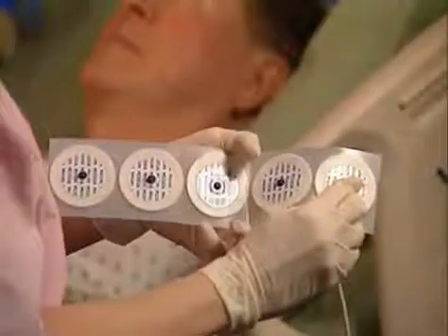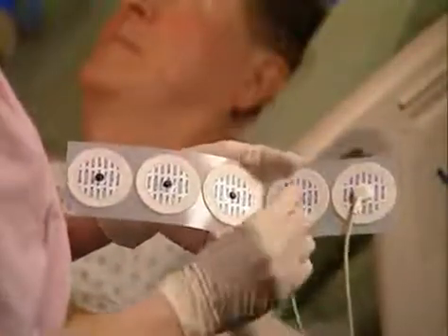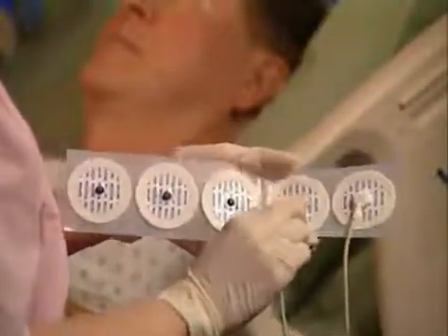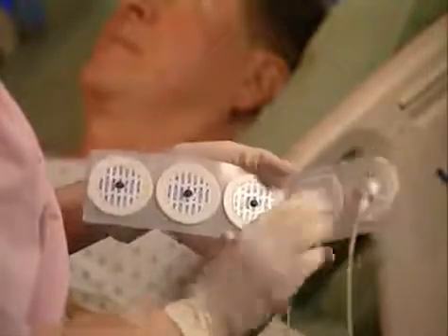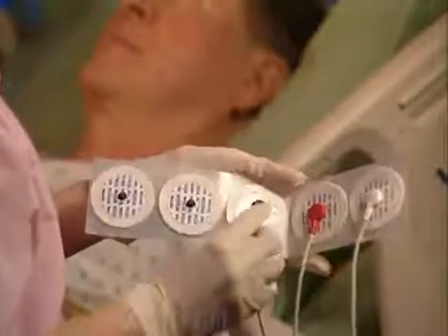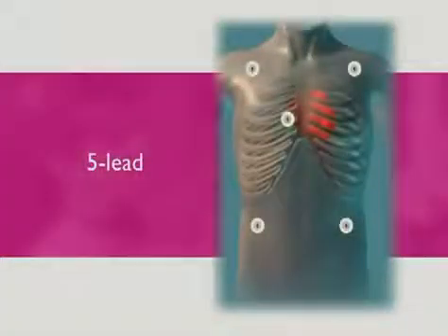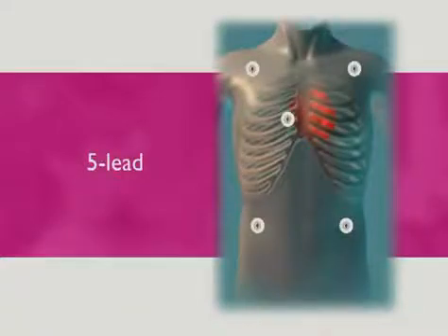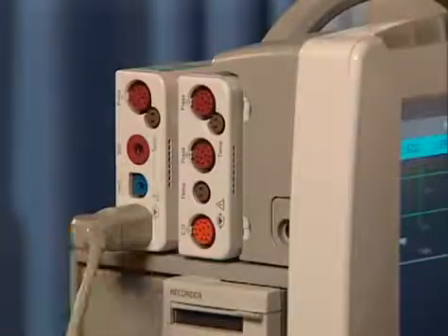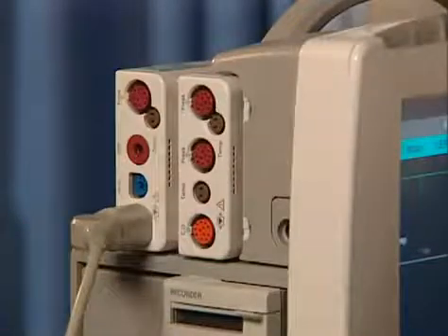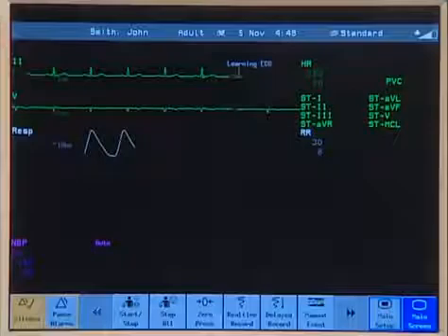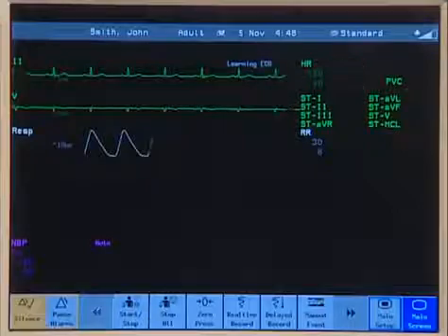After completing proper skin prep, attach the clips or snaps to the electrodes before placing them. Place the electrodes on the patient according to the lead placement you have chosen. Connect the patient cable to the ECG connector on the measurement server. The ECG waveform and numeric appear on the monitor display.